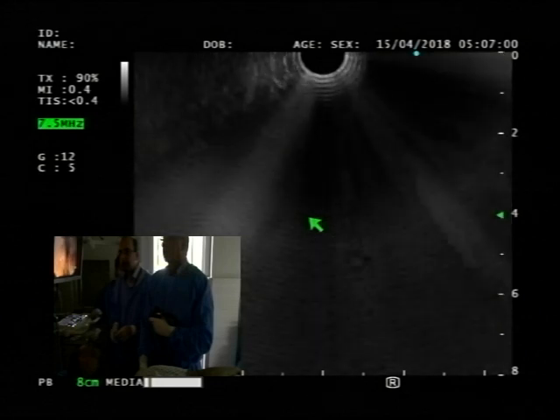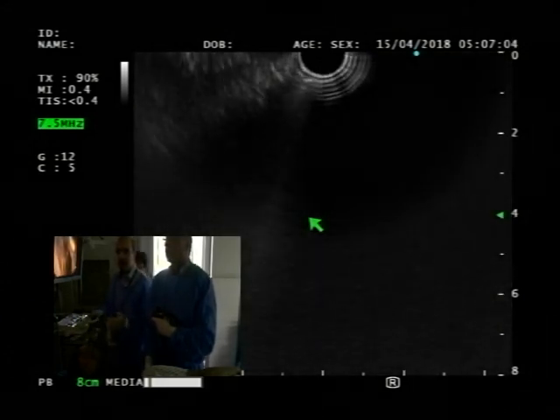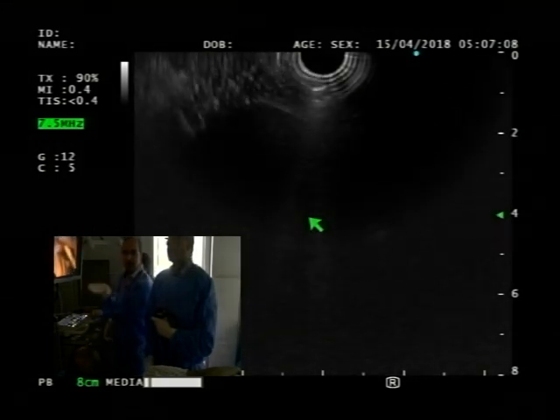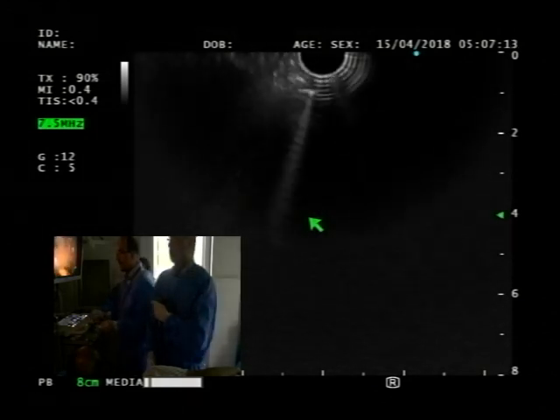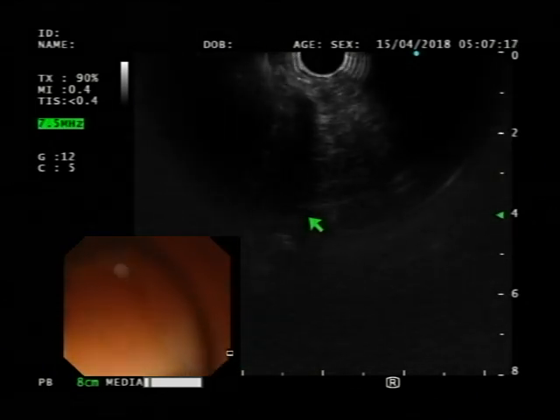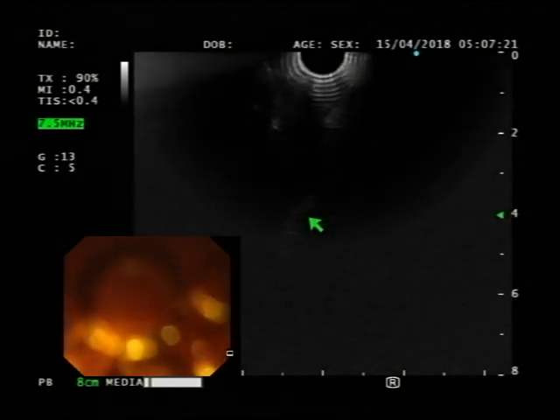All right. So now come back to the papilla. Yeah, you can come back to the papilla. Now, again, thumb down, so you're getting apposition against the papilla. This picture is not good, but you want to go and stand there. I will brighten it in just a second, once we have apposition. Okay, let's see how that looks for us as well.